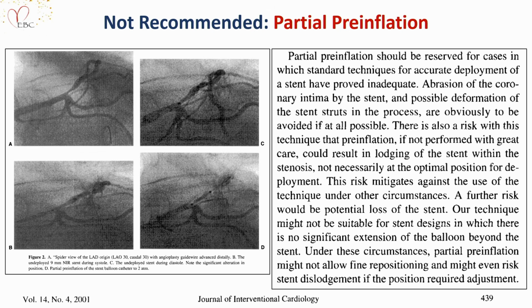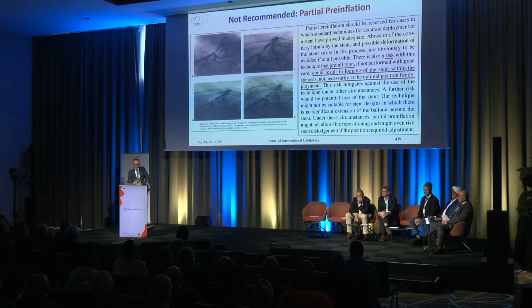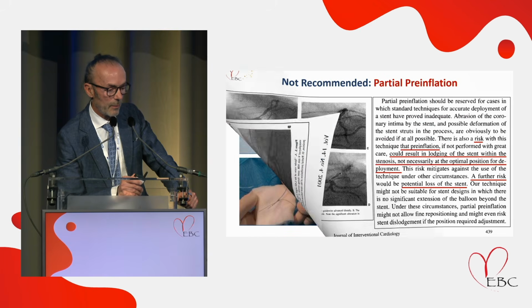It was the partial pre-inflation. I do not recommend it, because there is a risk that pre-inflation could result in lodging the stent within the stenosis, not necessarily at the optimal position, and also further risk of loss of stent.